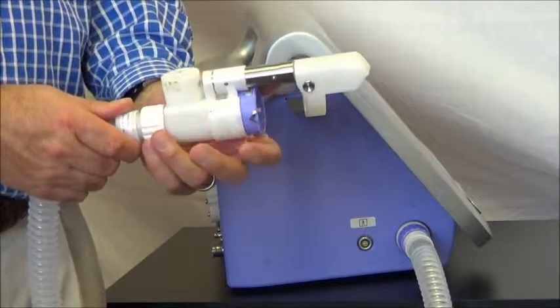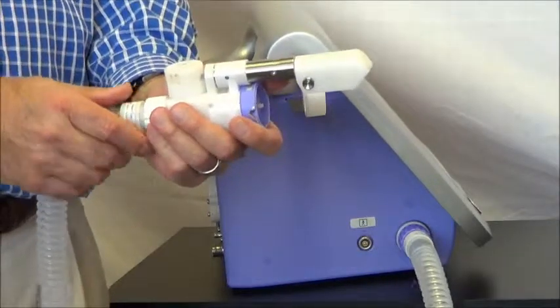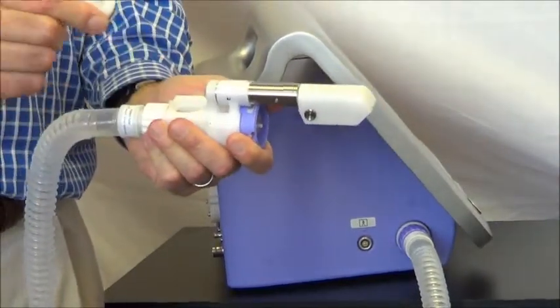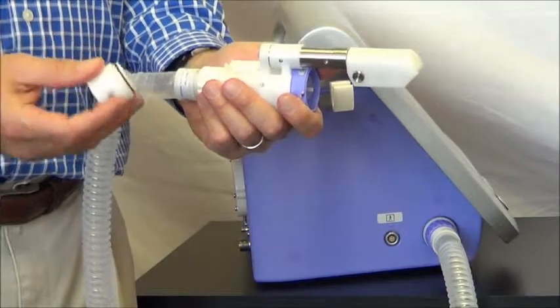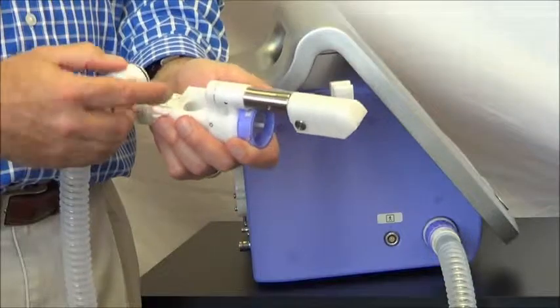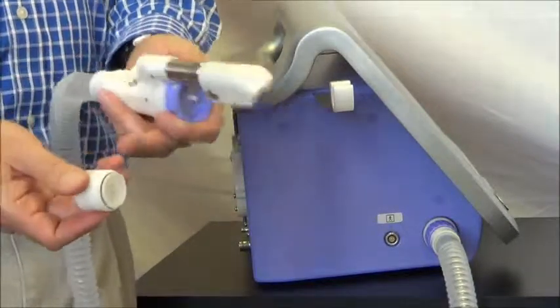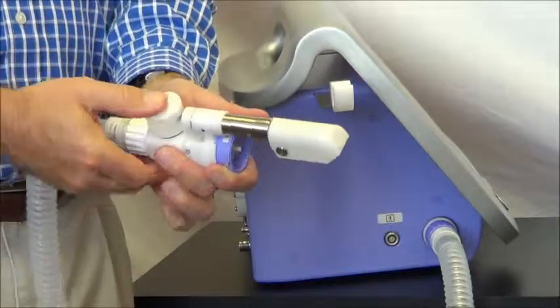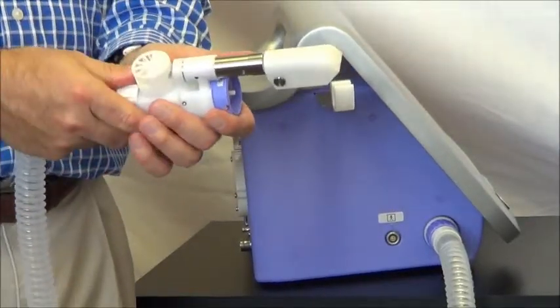The first part we're going to replace is the overpressure valve. It sits right here on the DLCO valve assembly, and it pops off quite simply like that. Take the new valve — you'll notice there is a notch on this assembly that matches up with a notch there. Simply match up those two notches and snap that down nice and tight.